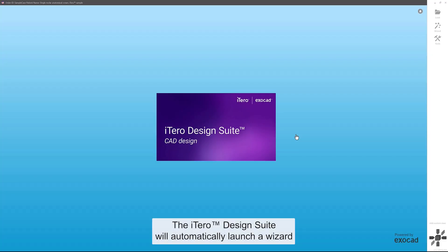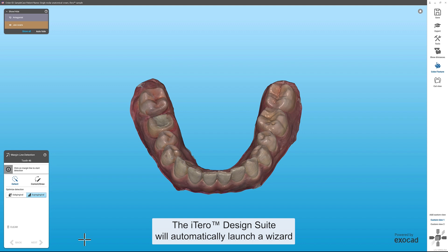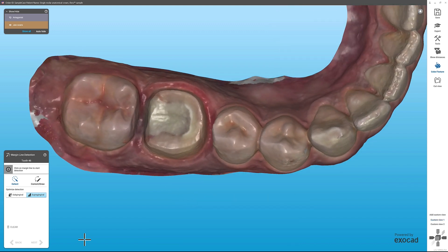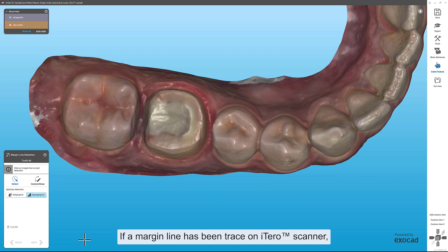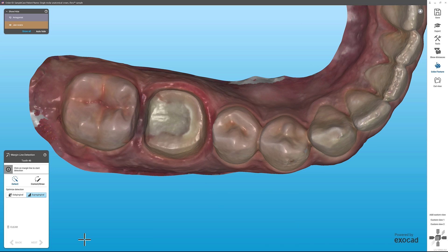The iTero Design Suite will automatically launch a wizard to guide you through each step of designing a single crown. If a margin line has been traced on the iTero Scanner, the margin line will be automatically detected. If not, it is easy to detect and to edit with just a few clicks.